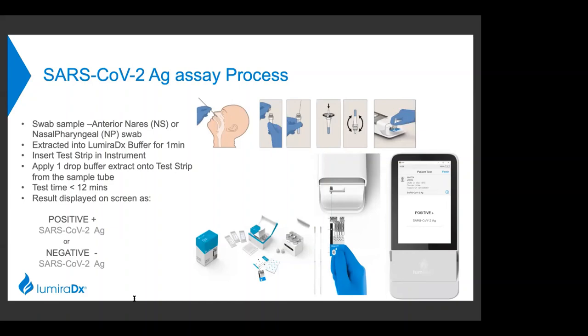And then that's taken out and placed into our extraction buffer. Our extraction buffer is in a small dropper bottle that's provided with the kit. So here the sample is extracted, the swab is placed into it, it's held in there for a few seconds, and then it's swirled around, and then you hold the tube, which itself is quite flexible, and then pull out the swab. Then we have a dropper bottle, a top goes onto the dropper bottle itself, and that screws on, and then it allows one drop of sample to be placed onto the test strip. The whole process here takes about a minute.